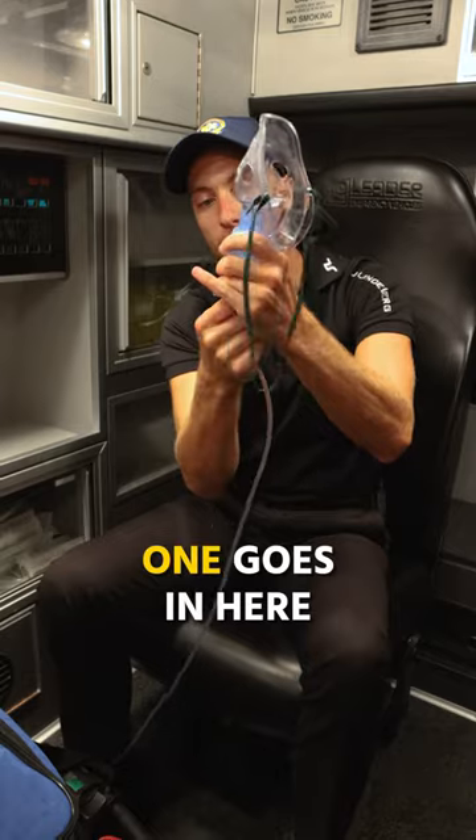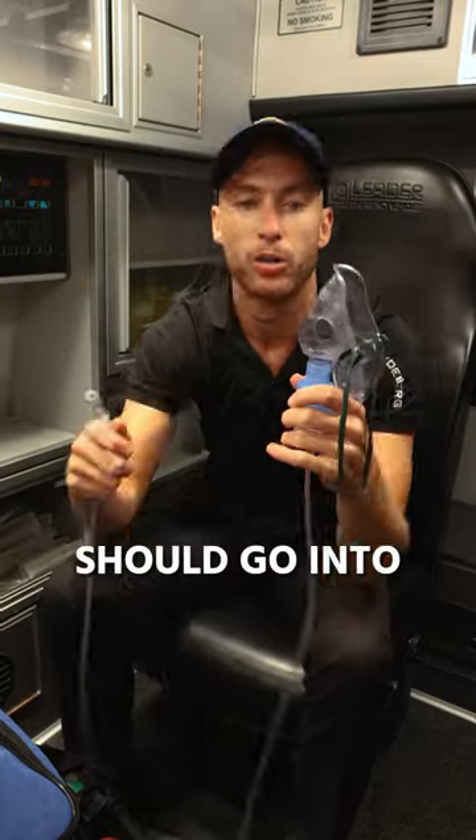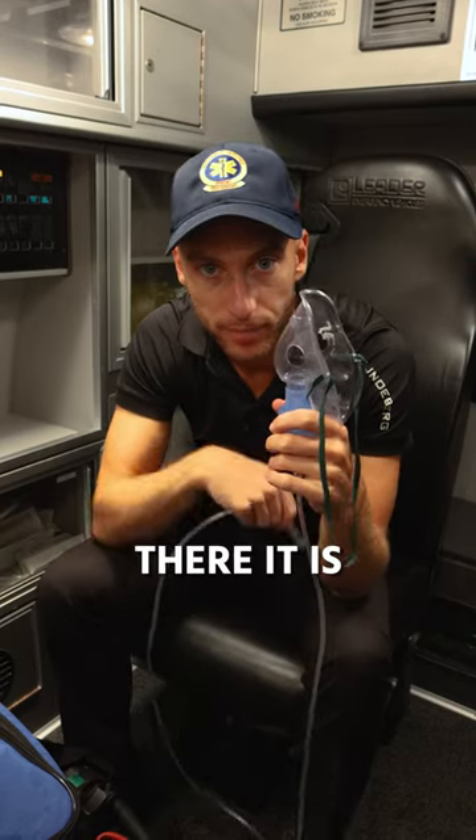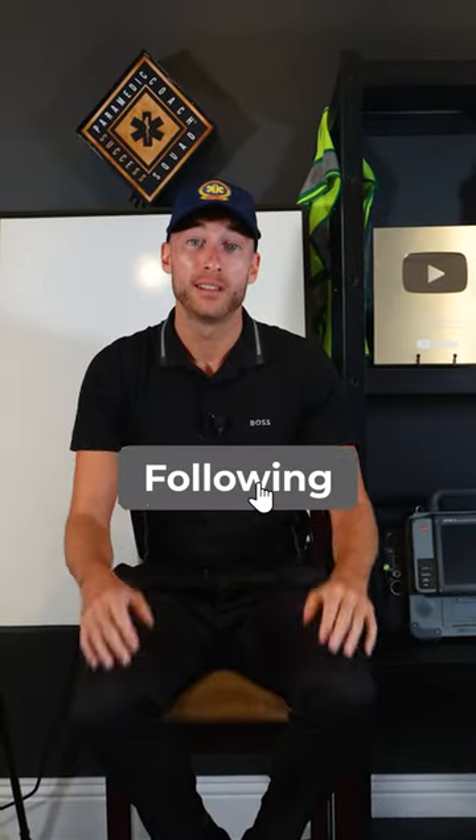Then part one goes in here, and part two is going to go into the oxygen tree — six to eight liters. There it is. Follow for more NREMT tips.